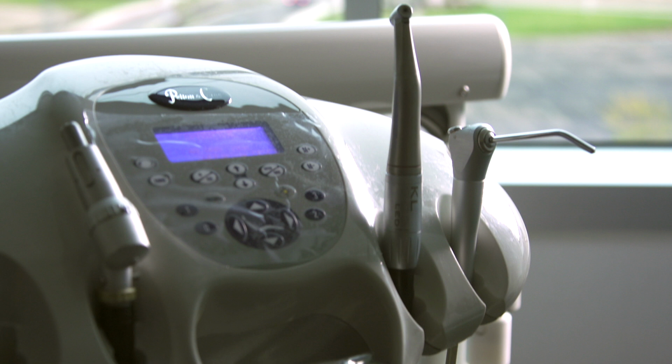I've heard that in recent years, bacteria in dental water lines have been causing some serious issues. Can you explain the causes behind this? Certainly. The narrow tubing, warm water, periods of stagnation, and dental unit water lines all play a part in expediting bacteria growth. In fact, many people have become affected by this problem.